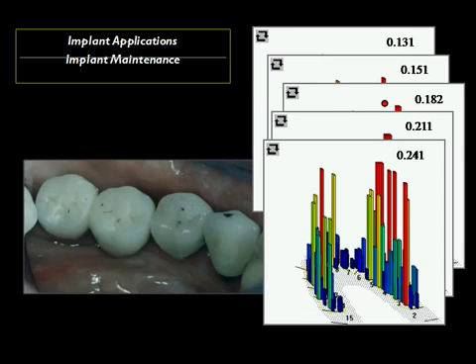As we play it forward, 0.02 of a second later, we can see that our most significant contact is in advance of the implants themselves. We continue to play forward, and now the force is being generated, and finally, force comes onto the implant, the terminal implant, the anterior implant, but force had previously been generated in the anterior teeth, allowing these anterior teeth to depress and the contact to occur. All of this, as you see, occurs within just over 0.1 of a second.